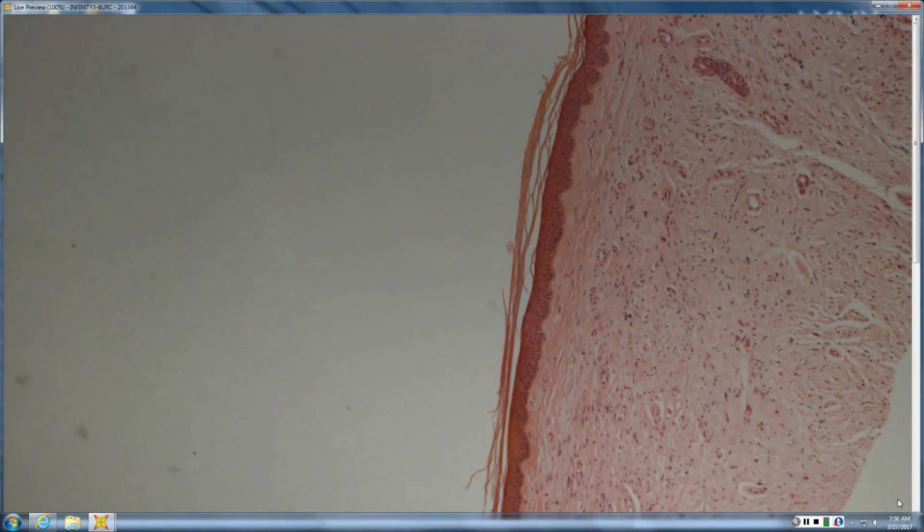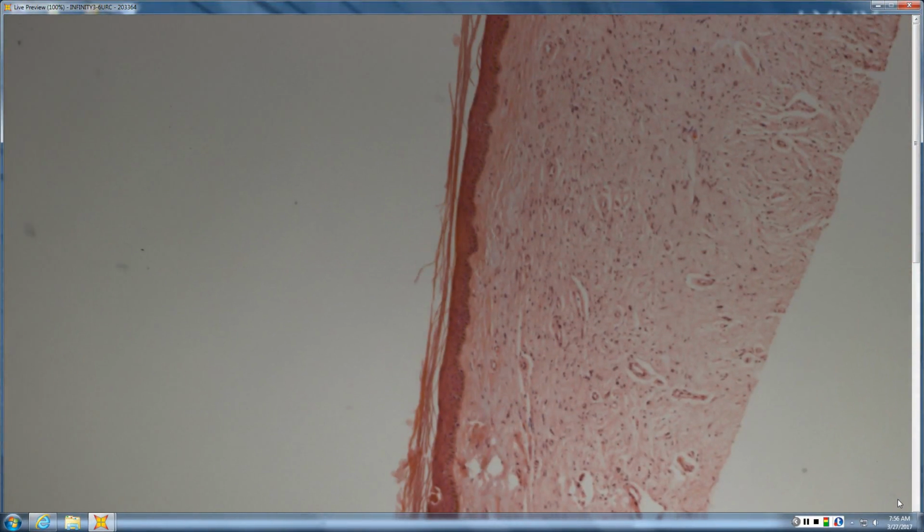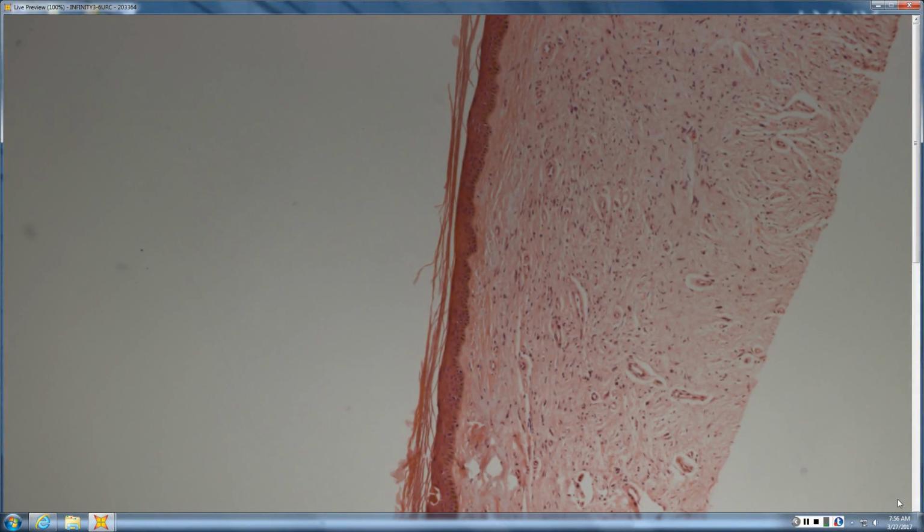So are you telling me that atypia alone doesn't mean much in a neural crest lesion? That's what I've heard. I wouldn't know. So you've heard tell that atypia alone doesn't mean much in neural crest lesions. And sarcomas in general, especially translocation sarcomas, tend to be hypercellular rather than atypical, right? And this one is not hypercellular. So the key is no mitoses and it's not hypercellular.